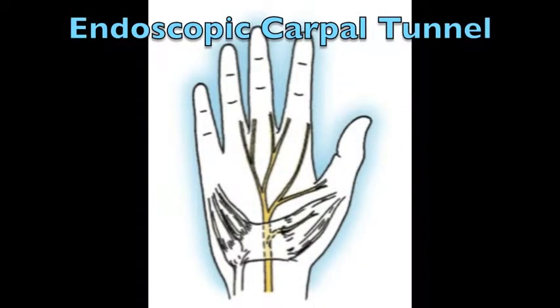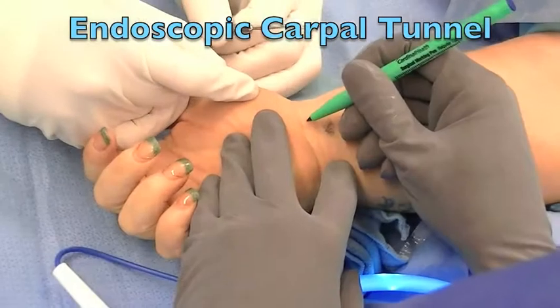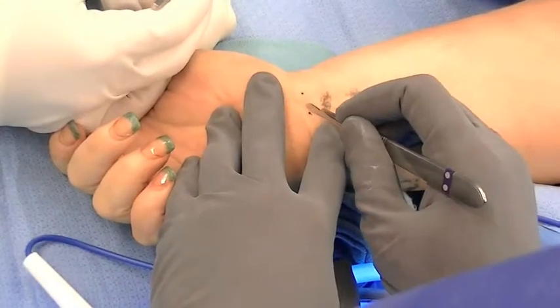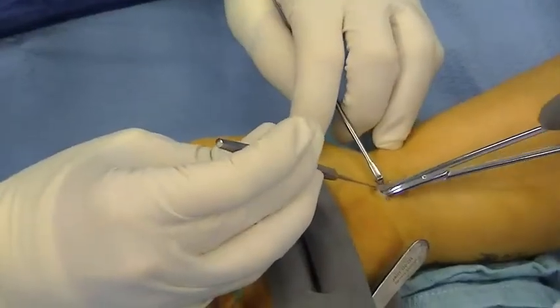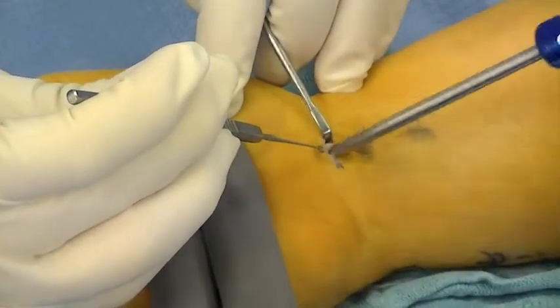Endoscopic release of the carpal tunnel allows for minimally invasive surgery and avoids painful scars in the palm. Here a small incision is made at the level of the wrist and the retinaculum, or flap of ligament, is retracted to protect the palmar cutaneous branch.